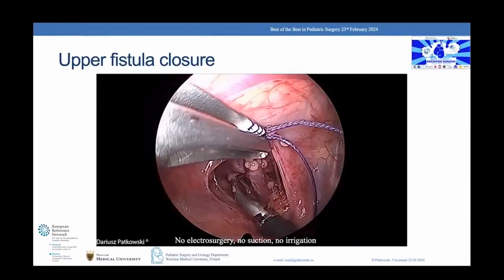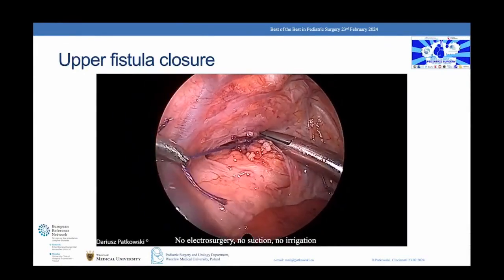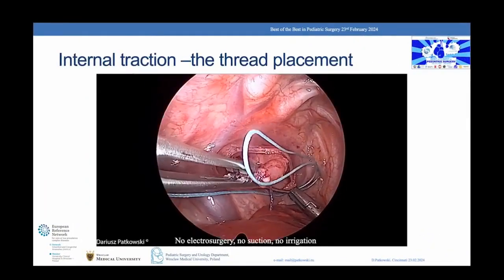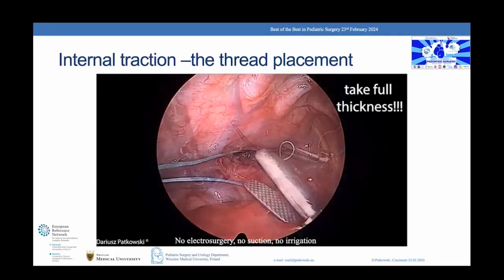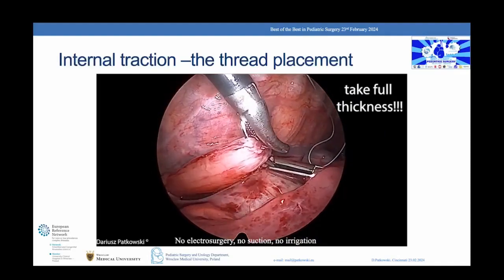The fistula is ligated on both sides and cut. Instead of a ligature, you can use clips or a 5 mm stapler. Placing the internal traction suture requires full thickness of tissue, including the mucosa layer. For internal traction, we use a 2-0 non-absorbable braided suture.